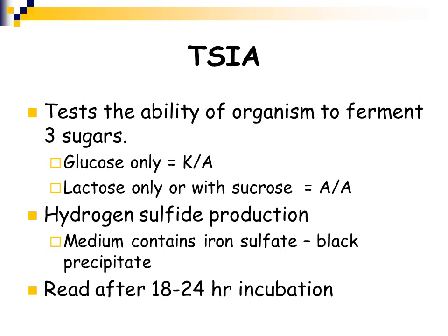For the sugars or carbohydrates that are tested in triple sugar iron agar, if the organism ferments only glucose, which will be all of your Enterobacteriaceae family members because they all ferment glucose, the butt of the tube will be acid. It will turn color. If you have either just lactose fermentation or lactose and sucrose fermentation, the slant of the tube will turn a color. It will be acid.